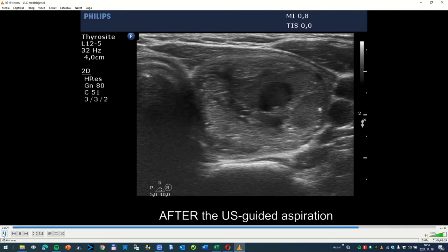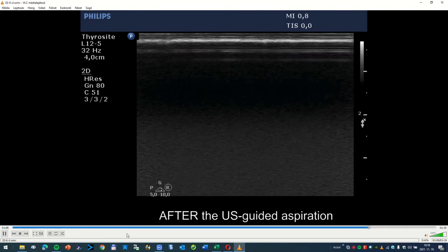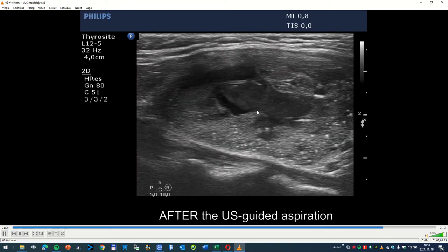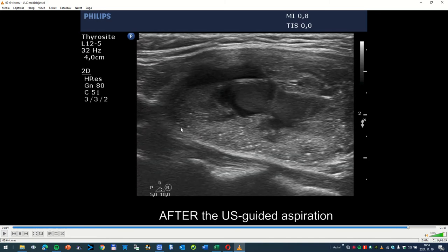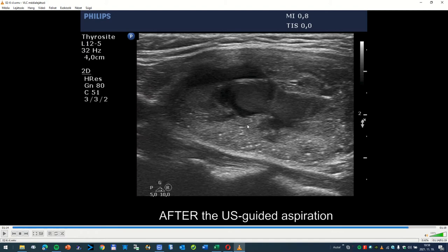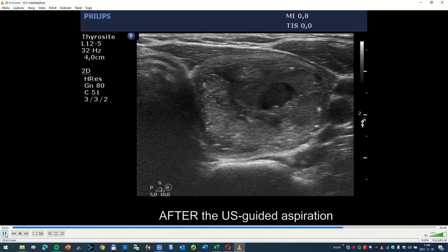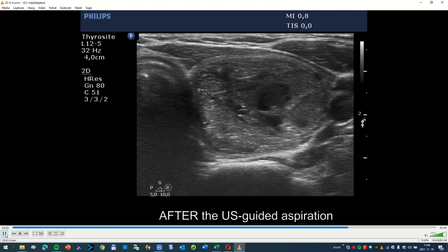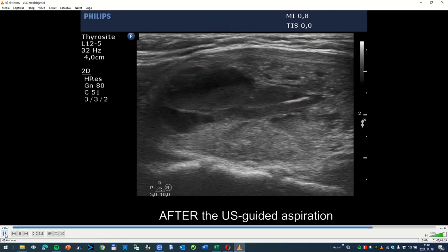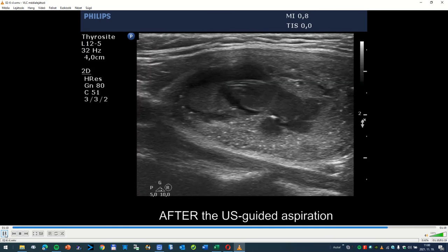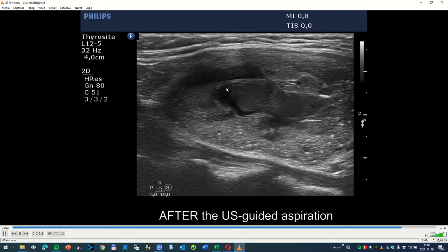This is the second phase of aspiration. After the aspiration, we can see this cloudy mass, which corresponds to the refilling of the nodule. The removal of the cystic fluid had tamponated the vessel, and after relief of this tamponade, the vessels started to refill the nodule. This structure corresponds to fresh blood. This is not a very rare situation — one to five percent of mainly large cysts refill just after the removal of cystic fluid. This is a very characteristic sign.